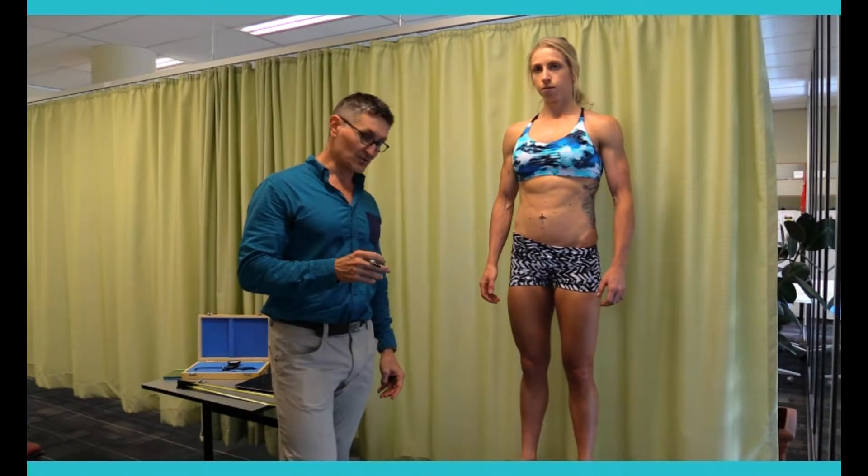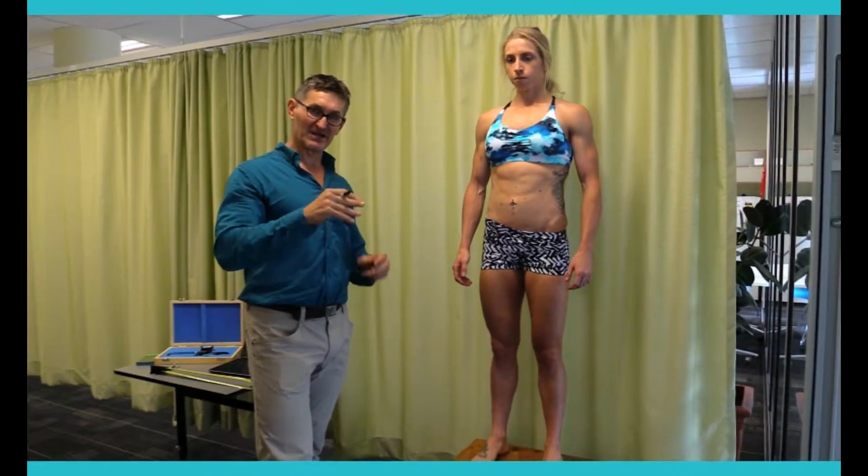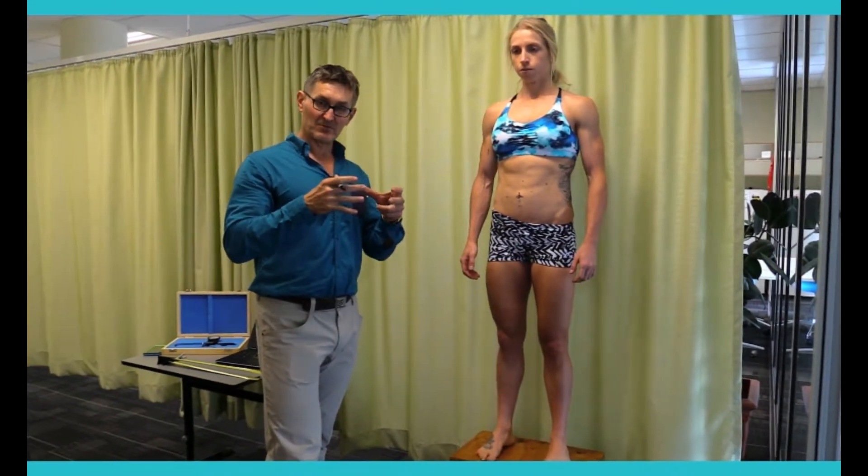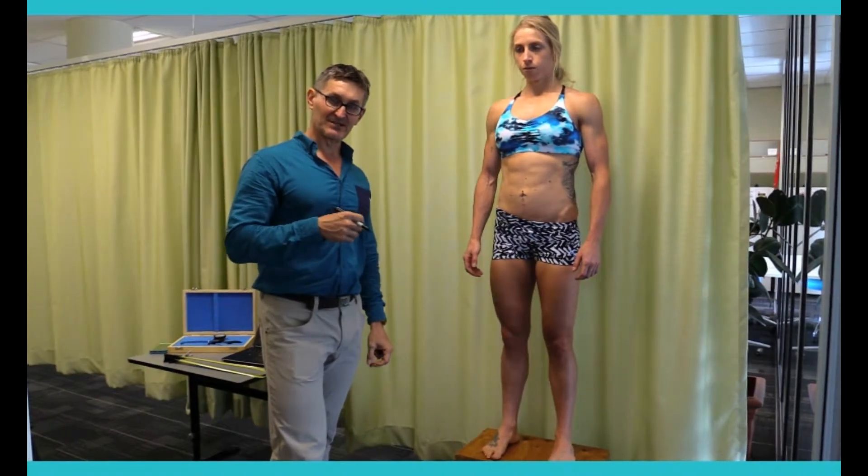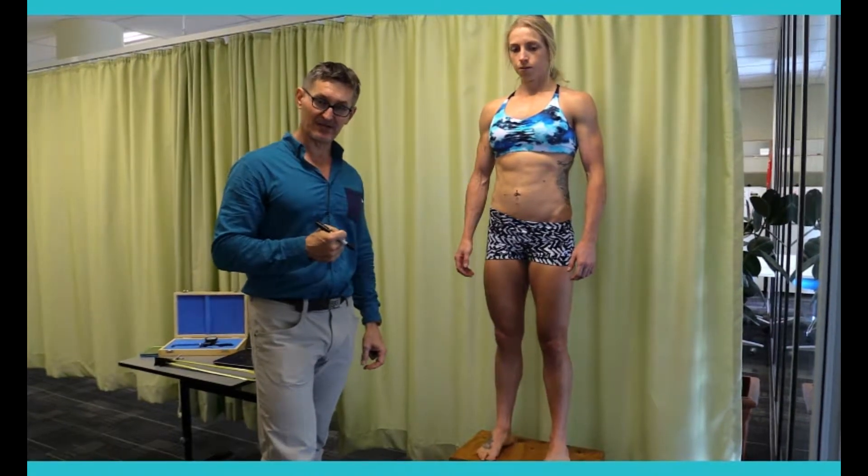To be able to ensure that I can have my eyes at the level of her calf to identify the maximum calf circumference, because that is the anchor point from which we're actually going to take her skin forward for her calf.